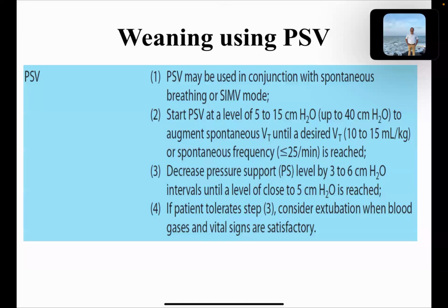So what is the pressure support? What is the minimum pressure? If it is 10 to 15, then probably he will take a few more days. You need more respiratory rehab during that time. But if he's coming gradually to 5 centimeter, 4 centimeter of water, then he can be extubated.